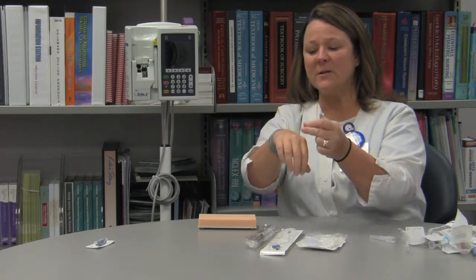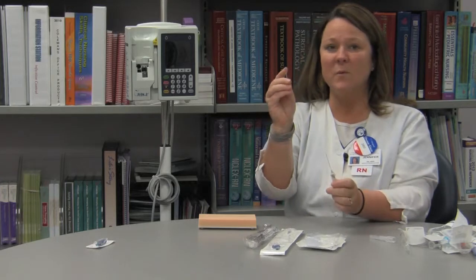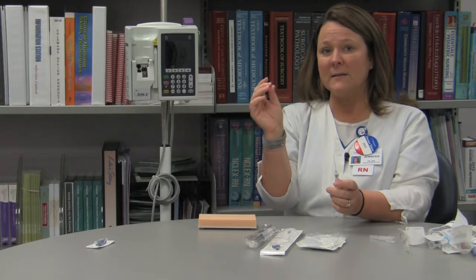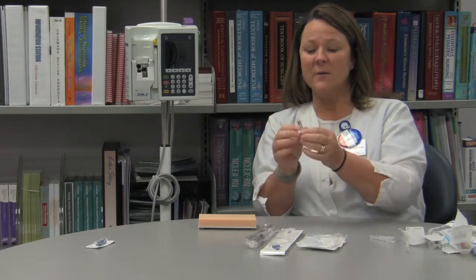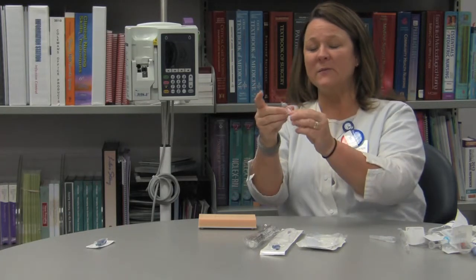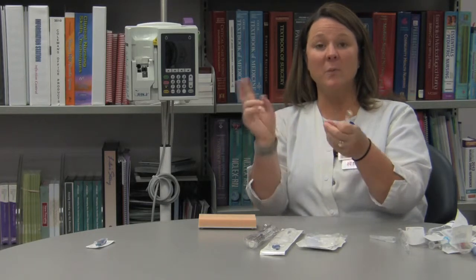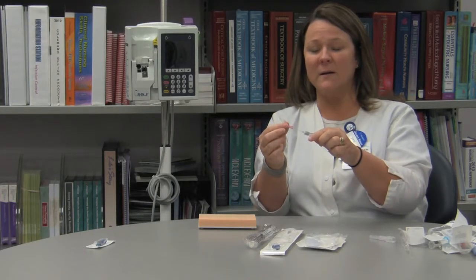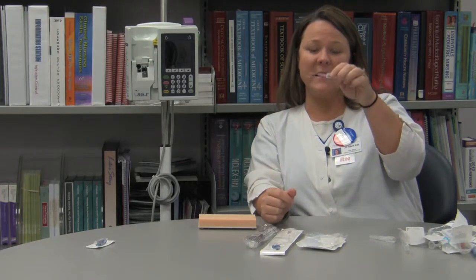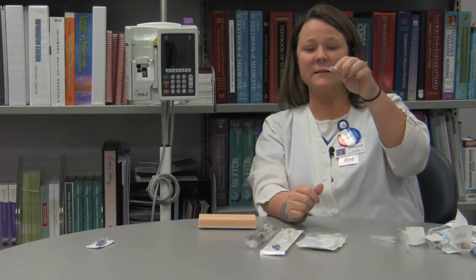Once it gets in the patient's vein and that warm blood hits it, it becomes even more flexible. So it's best to thread your catheter as quickly as possible. Also, the needle on these is really sharp. If you're not careful, you'll go right through the patient's vein and blow their vein without even knowing you've done so. So anytime you're starting an IV using this angiocath, be sure you rotate the hub 360 degrees.